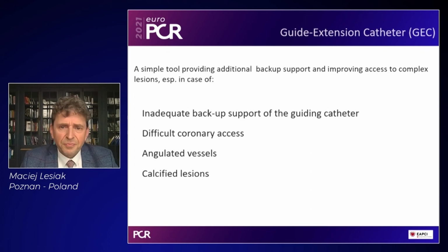One of the very simple and at the same time very useful tools is the guide extension catheter. It is a tool providing additional backup support and improving the access to complex lesions. And especially in the cases of inadequate backup support of the guiding catheter, in a difficult coronary access, in angulated vessels, or calcified lesions.